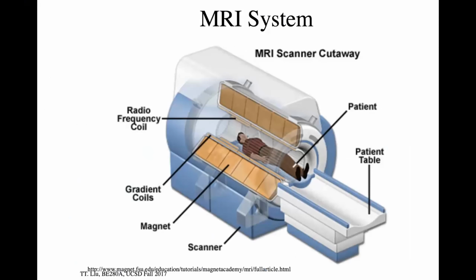So MRI came along in about the 70s. I think the notion that you could do imaging with magnetic resonance. Initially, nuclear magnetic resonance was used as a tool in chemistry for looking at chemical compounds by taking their NMR spectra. So the systems were available for small samples, but the field gradients that we'll discuss today, which were also available, were used to make the main magnetic field very uniform.